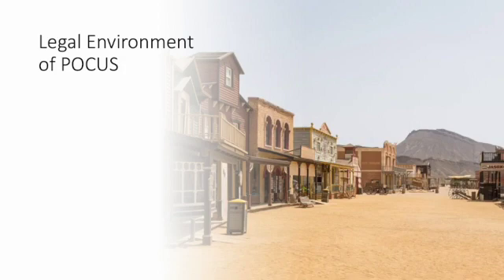The legal environment of POCUS, the picture I have to represent that here is a picture of the Wild West. And that's because this is very much a Wild West area of medicine, meaning that by and large, there aren't any big guiding organizations or national standards that help to drive home what the standards are for practicing this. We have a lot of people that just bought a Butterfly off the internet and they're really excited to use it, but they may not know completely what it is that they're looking at.